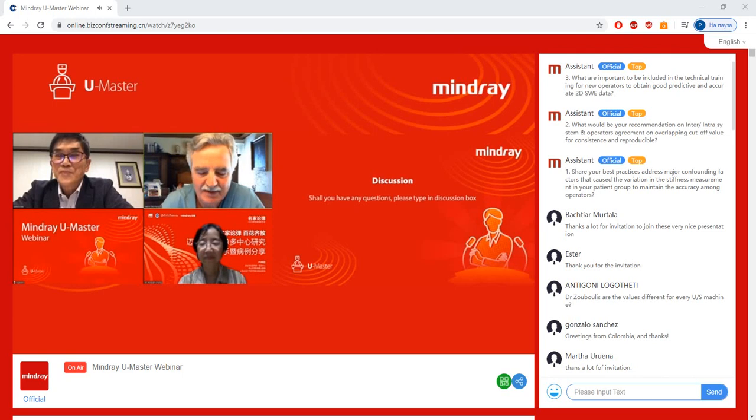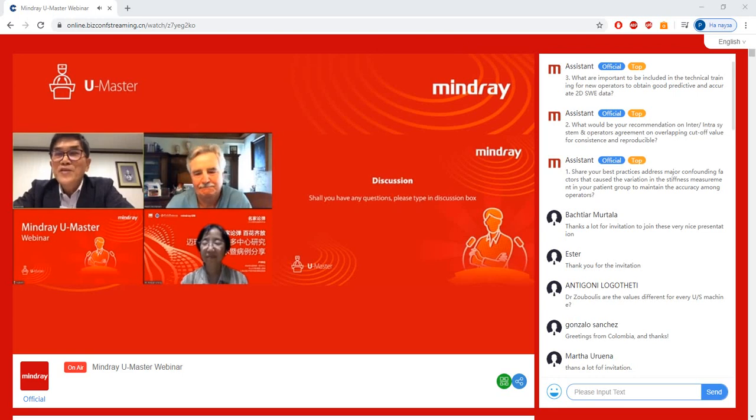B mode examination is the base of every shear wave examination. And the second thing I want to underline: stability of the hand and the probe, and immobility of the liver. Thank you very much. We look forward to the second part of your lecture in the next webinar.